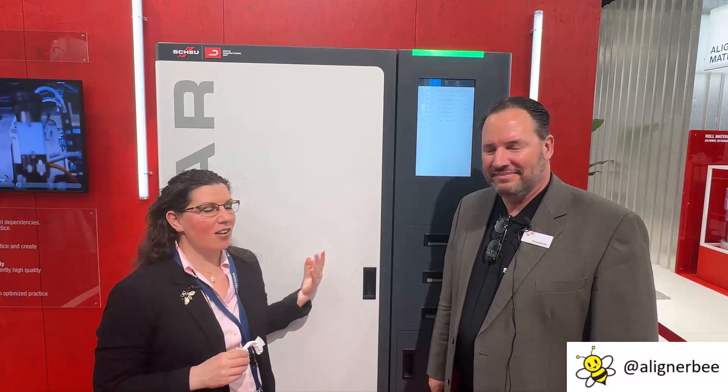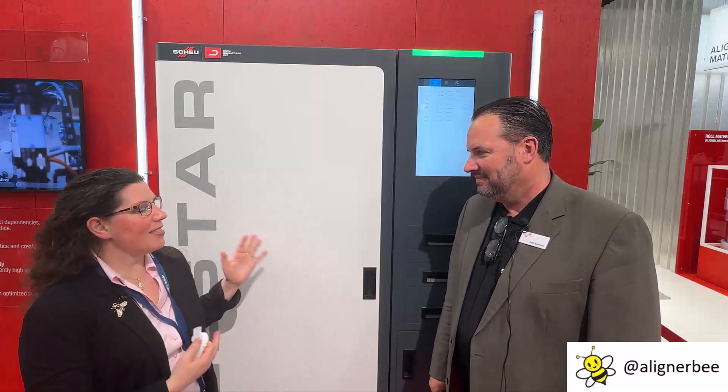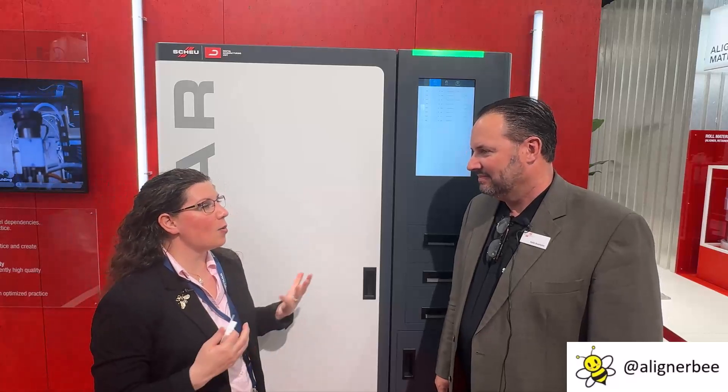I've invited Keith Batchelor here from Scheu to join me today so that we can talk a little bit about the All-Star. This is a fantastic addition for the dental laboratory space. So many of us are looking for automation. Let's talk a little bit about the process when we're in the orthodontic office and we have a patient that wants to get started the same day.